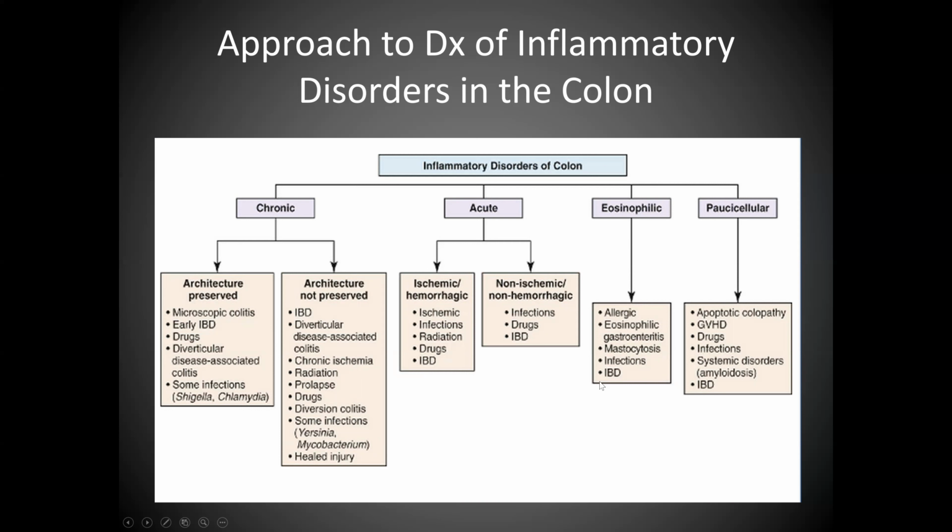So inflammatory bowel disease is always in the differential. It may not always be at the same stage or same degree of severity or significance, but it's always in the differential with any of these patterns. And then you can come back and look at these at your leisure when you are thinking about things.